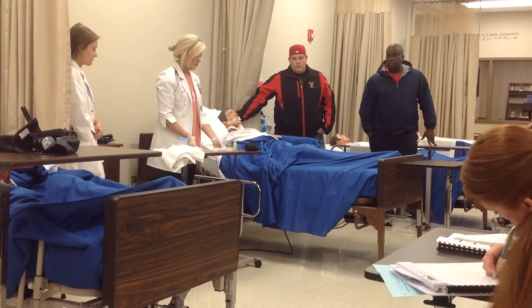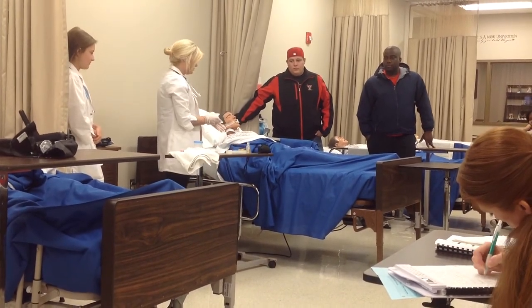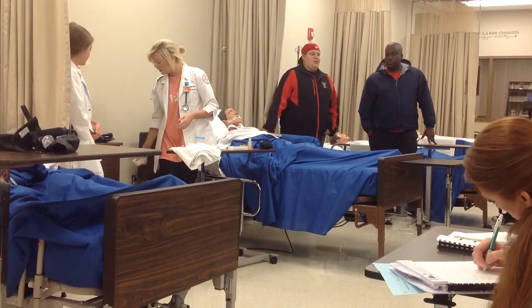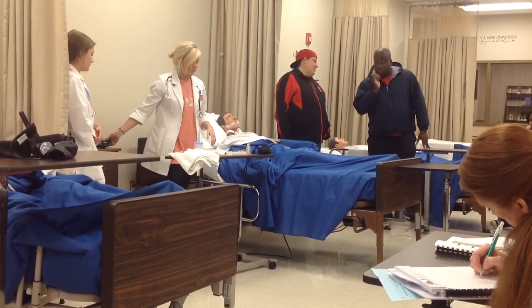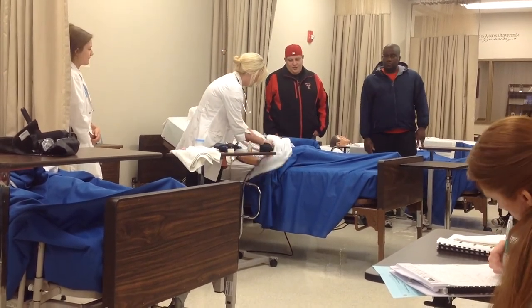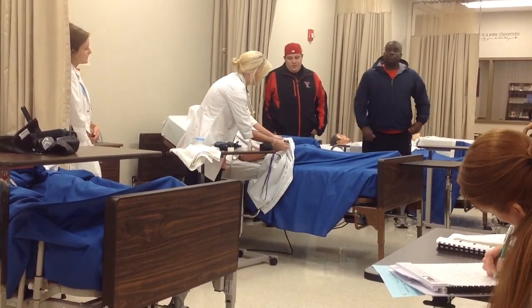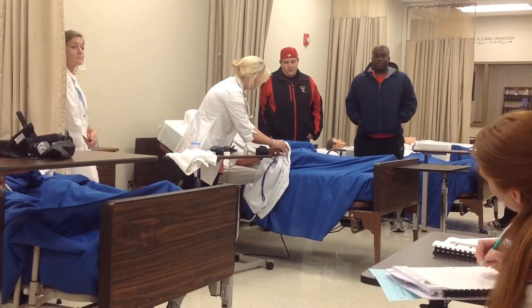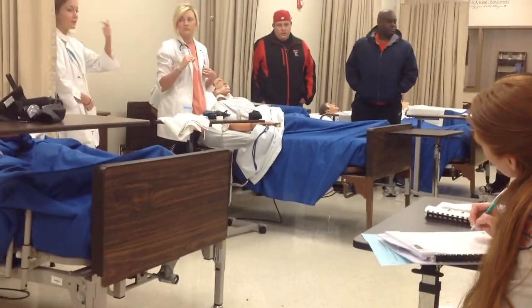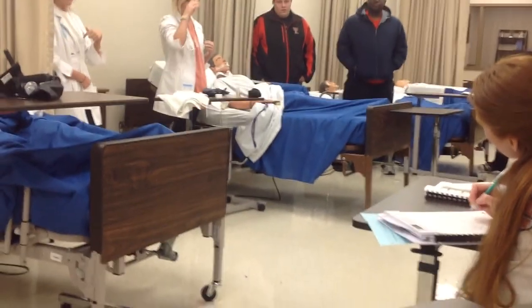And so after you do that, you're going to want to do a full respiratory assessment again, which would be your blood pressure. And you're going to put your pulse ox on. Right after you insert your oral airway, you need to do a respiratory assessment and make sure they're still okay. Make sure that they're breathing.